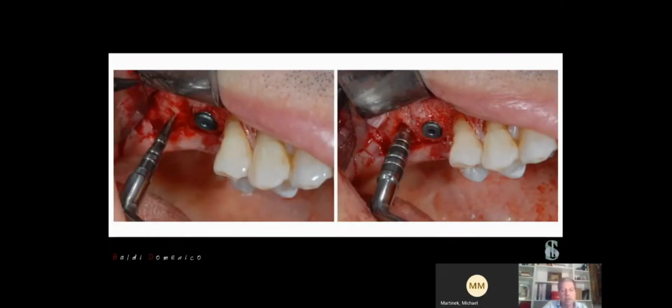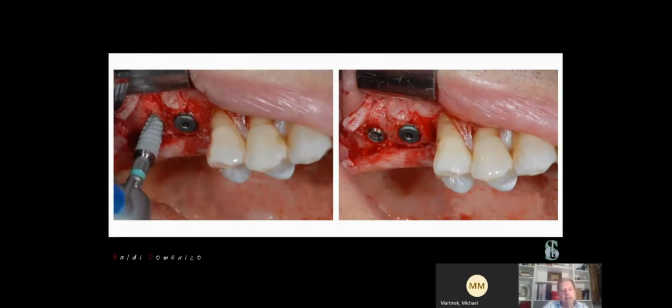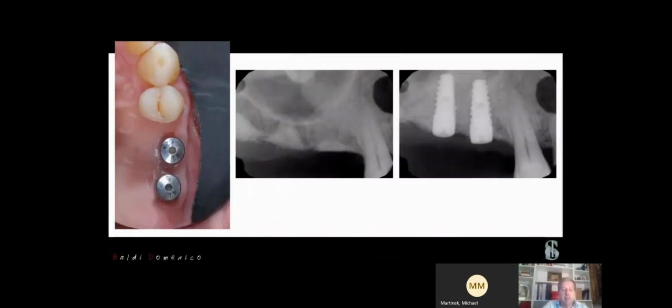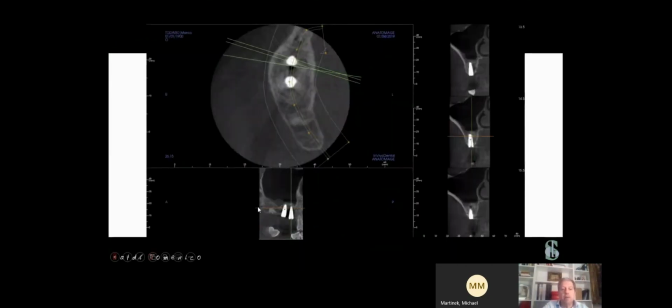As I told you, we use the classical approach. We use the magnetic mallet in order to create a crack of the internal cortical bone. Then we place our material, and then we place our implant. So we transform the situation from this to this. This is the X-ray after the placing of the implant. You can see how the design of the floor of our sinus has changed. It is completely changed.